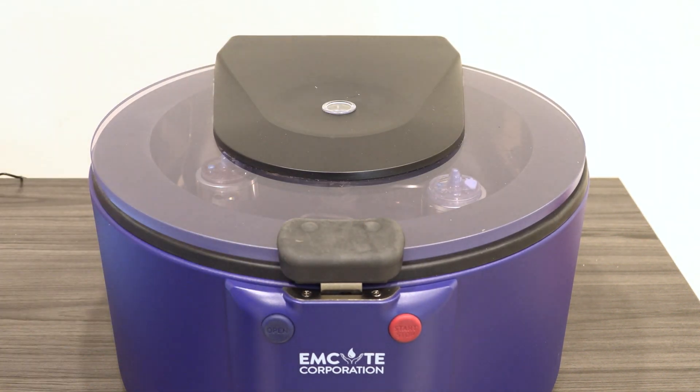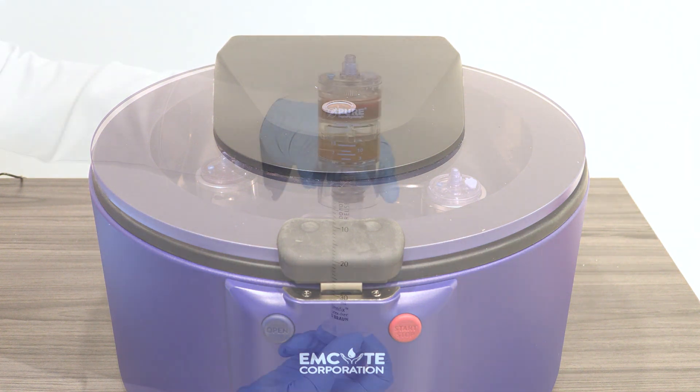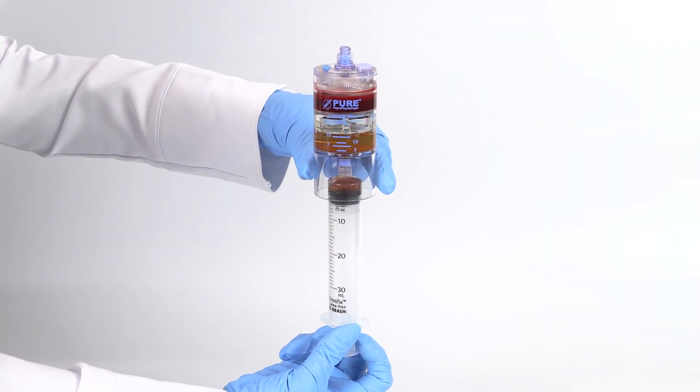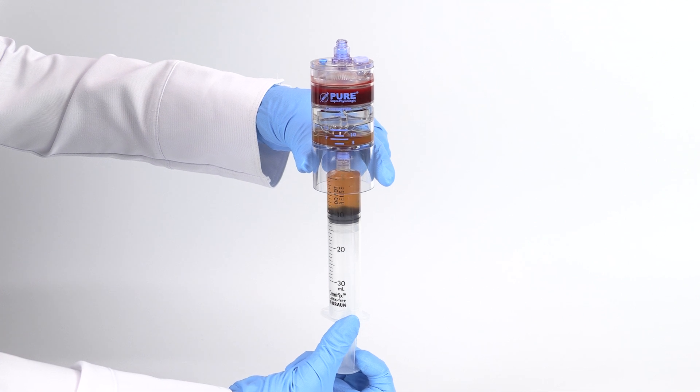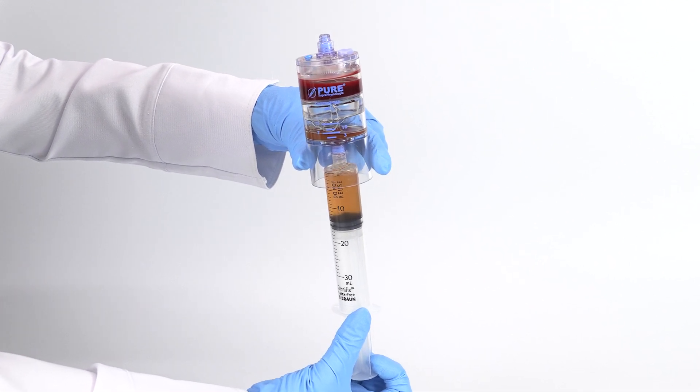Attach a sterile syringe to the needleless port and aspirate the bone marrow plasma, leaving 3-4 milliliters of solution in the device.